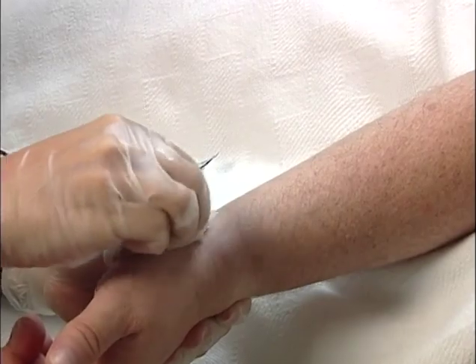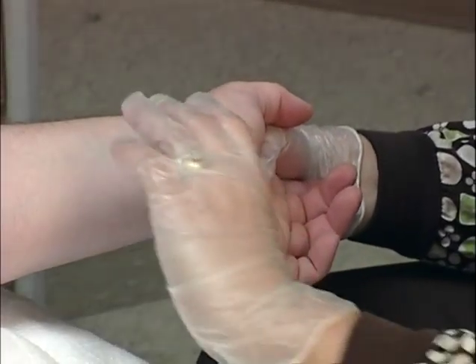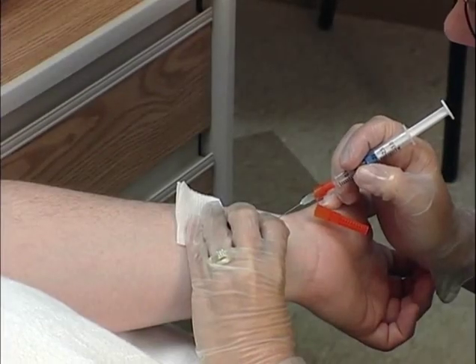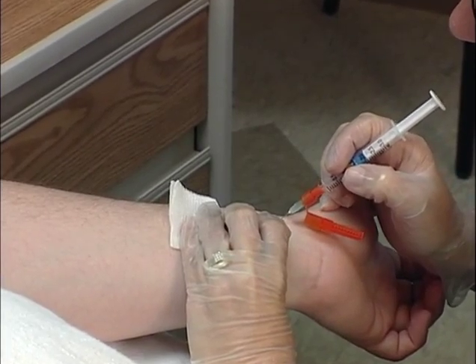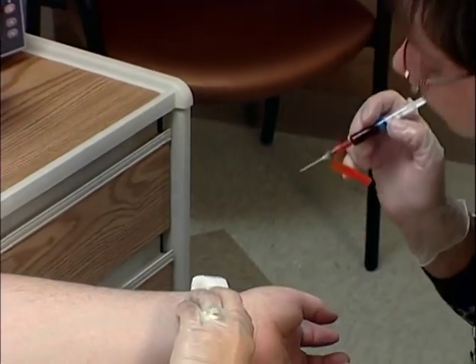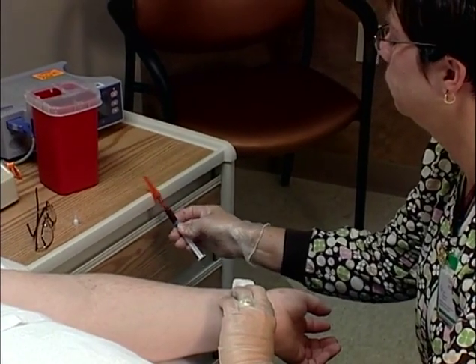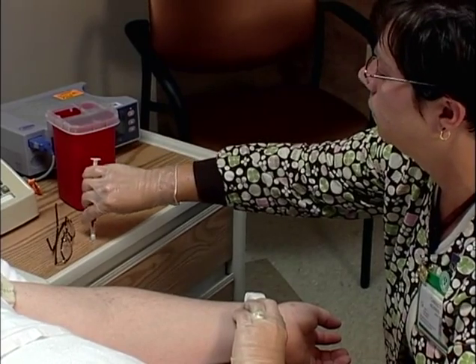Cleanse the site and allow it to air dry. For radial draws, hyperextend the patient's wrist. Perform the puncture, inserting the needle at an angle of 45 degrees or less, and allow the syringe to fill to the appropriate volume. Withdraw the needle and activate its safety feature or conceal the sharp immediately. Apply firm pressure to the puncture site for a minimum of 3 to 5 minutes.